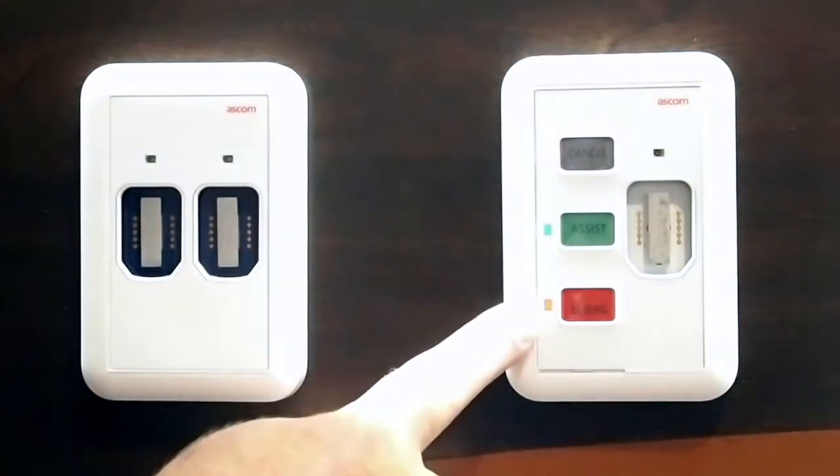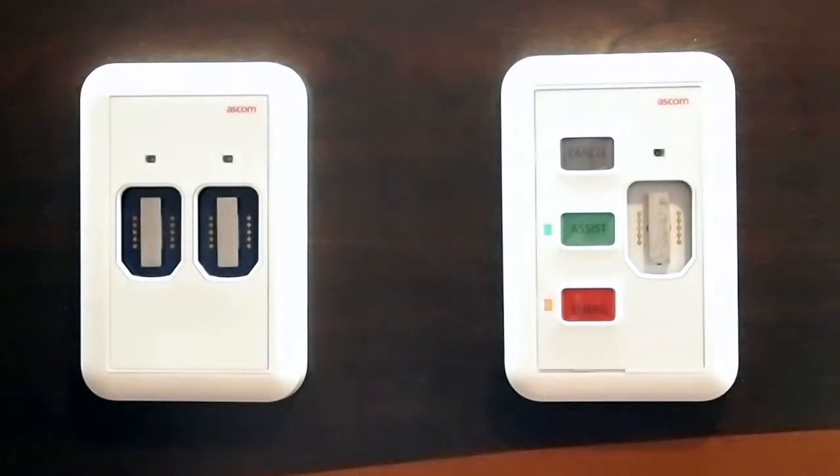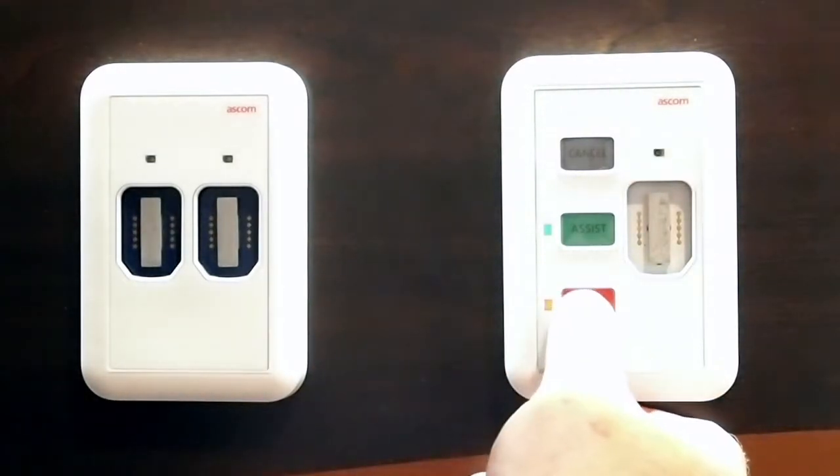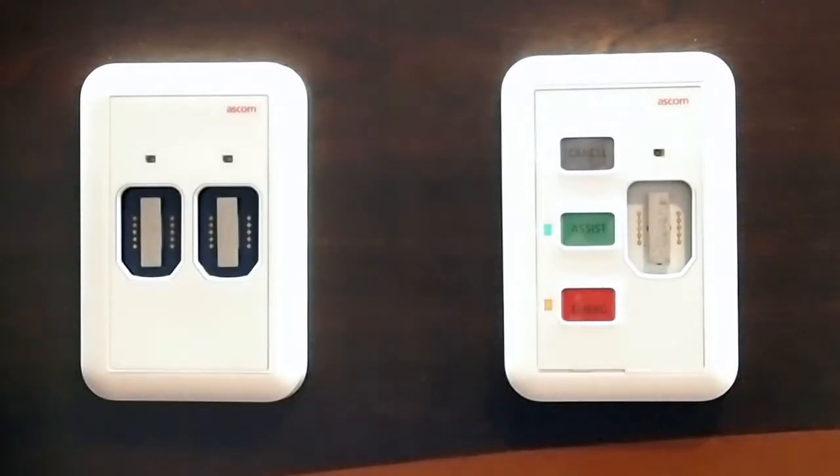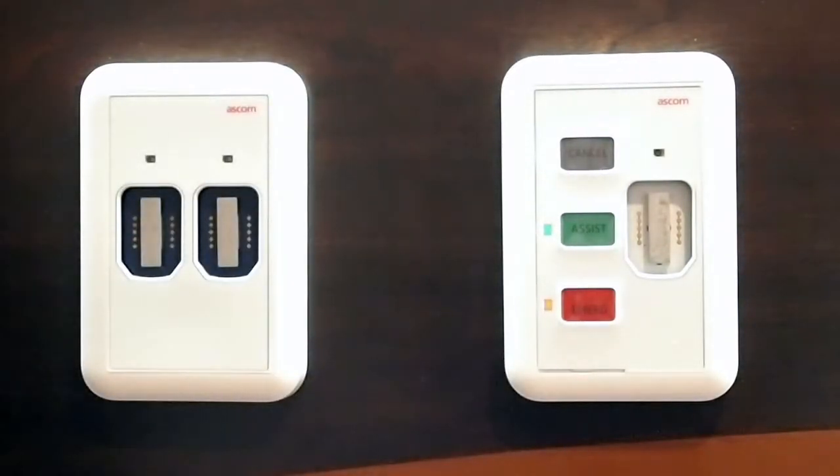We have dim lights on so that nurses can find those buttons in a dark room at night. And then when we place a call, it will light up brighter and you'll hear some phones ringing in the background as well. We can interface to any phones you may have within your facility.